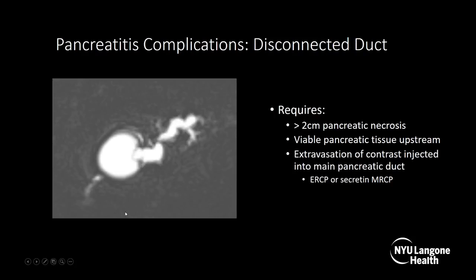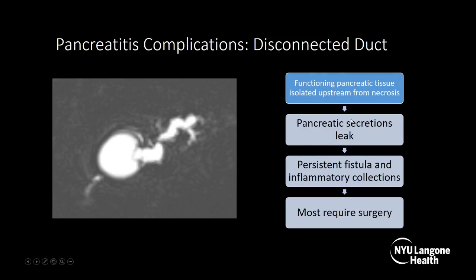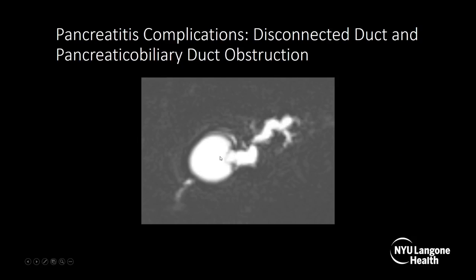On this coronal MRCP, there's a cyst and upstream the main pancreatic duct is dilated. There's an area that's discontinuous, and then the downstream portion is normal caliber. This is called disconnected duct syndrome, which requires over 2 centimeters of pancreatic necrosis and viable pancreatic tissue upstream. The viable tissue secretes pancreatic enzymes, causing leaking of pancreatic secretions that leads to a persistent fistula and inflammatory collection. Diagnosis requires demonstrating extravasated contrast through the main pancreatic duct by ERCP or secretin MRCP. Most cases require surgery — resection of the disconnected segment or a pancreaticojejunostomy. There may also be pancreatic biliary duct obstruction as well.